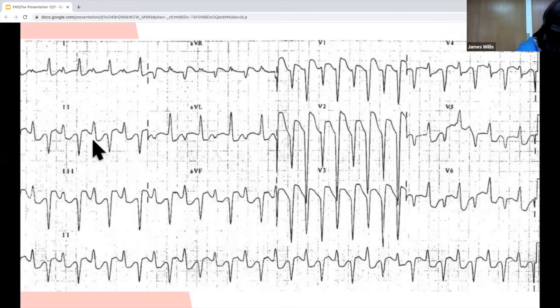I guess think here in lead 2. Wide, great. So they have, it's kind of an interesting combination. They have a supraventricular tachycardia because of that increased automaticity, and then they have a slow ventricular response because they have decreased AV conduction due to the vagal effects. So in the digoxin effect, you saw they had a mild PR prolongation from the vagal tone, but here it's much more severe.